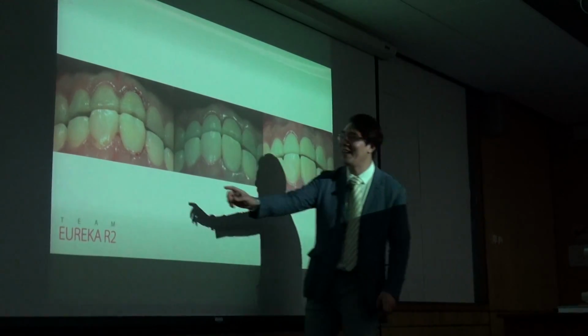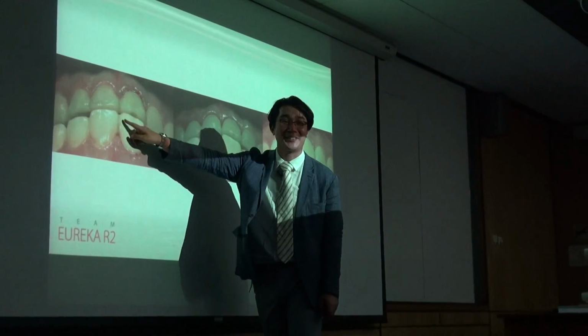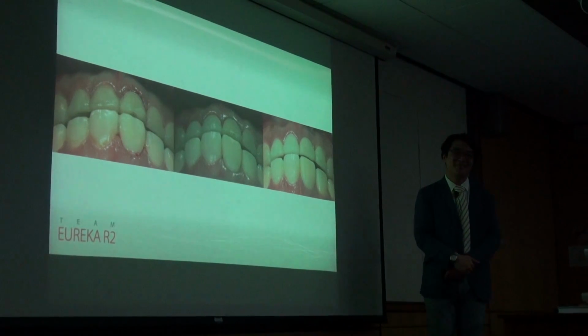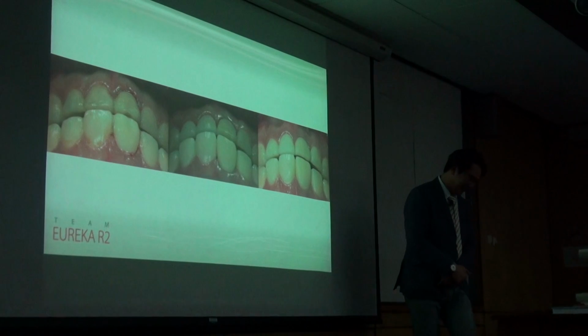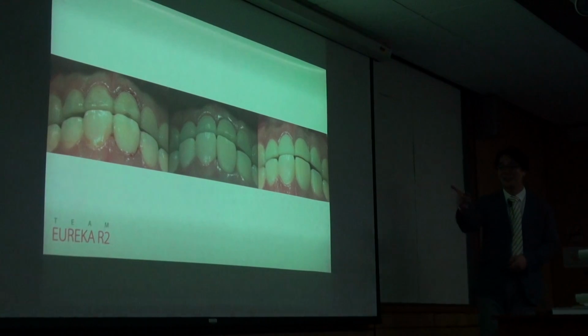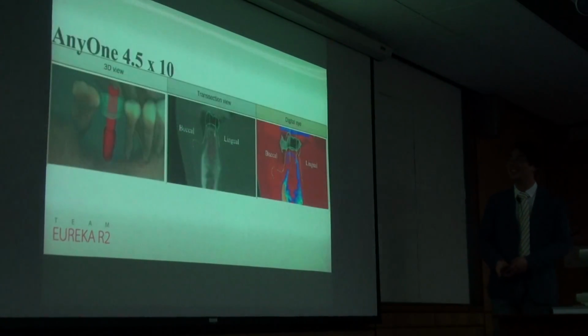So after placing the provisional restoration, I found some diastema. So there is bonding to close the diastema. You are not recommending bonding with the adjacent teeth for better stability? Right, because I obtained over 70 newtons, so there is no reason to splint it. Yeah, I was wondering, that's for the aesthetic reasons. Okay.